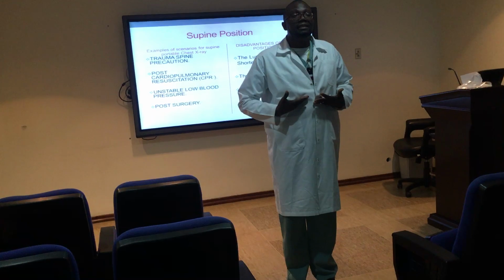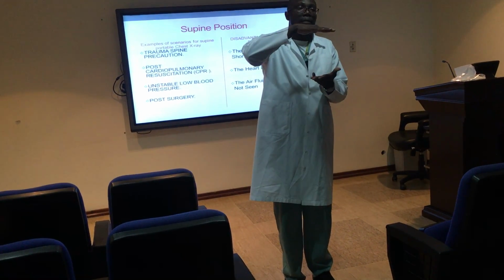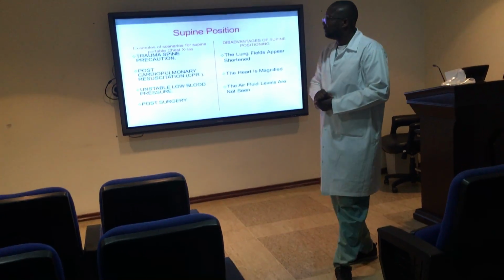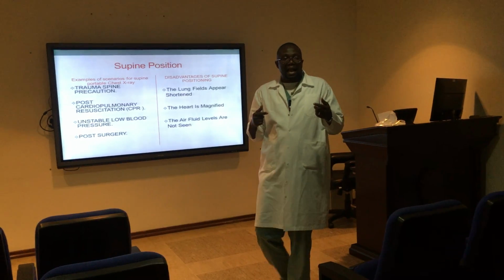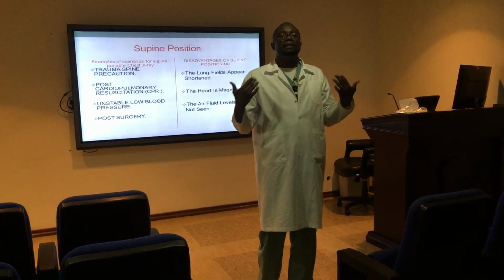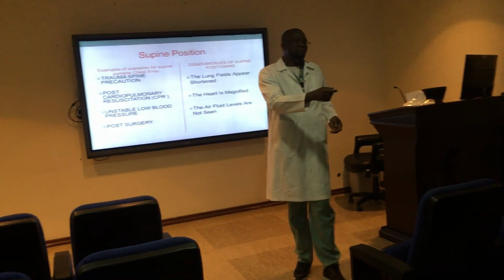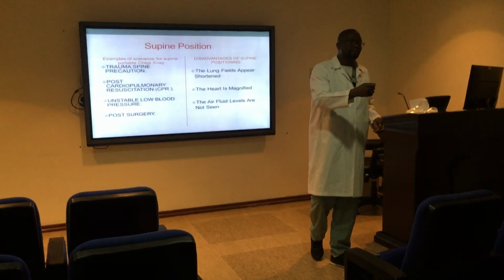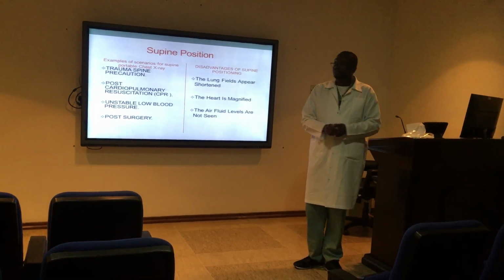So on the image, the lung will look not full, but short. The second one, the heart tends to be magnified when the patient is in a supine position. That is why portable X-ray is a limited exam, but it is necessary.